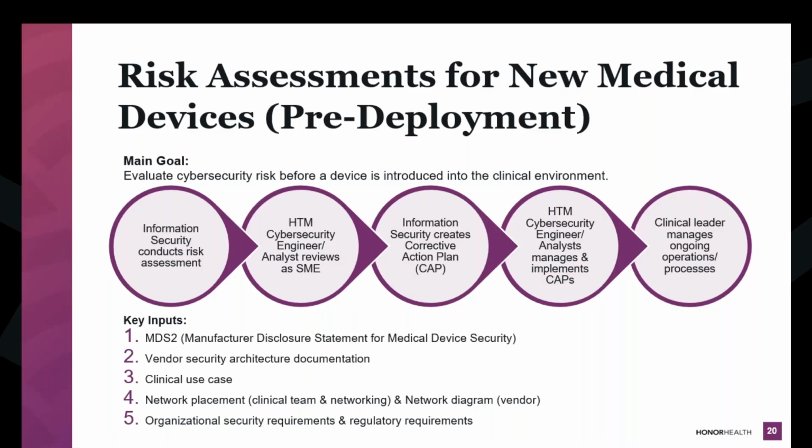I mean, do you have that authority? No, probably not. But if you tell your CISO we're not interested in doing business with you, okay? That it should be a requirement for every healthcare organization purchasing medical equipment. Get us that MDS2. All right, vendor security architecture. They typically have a security white paper of some sort that they can give you.